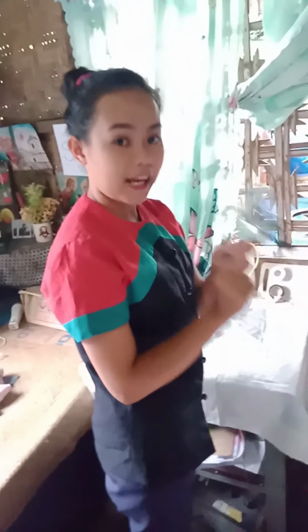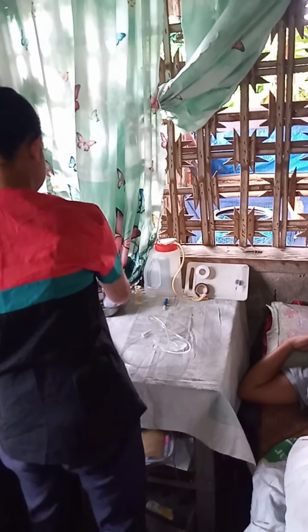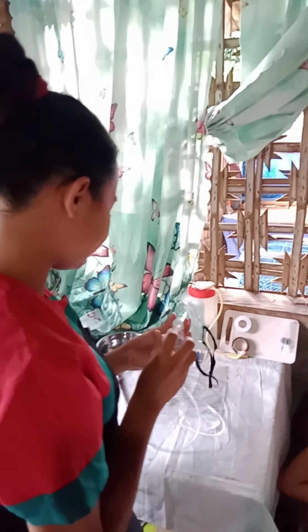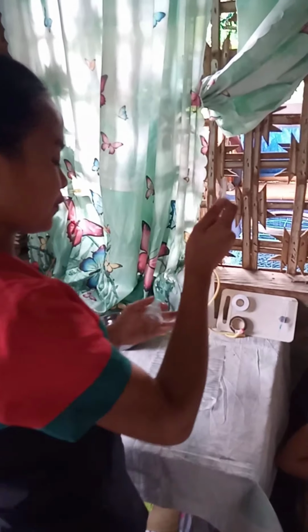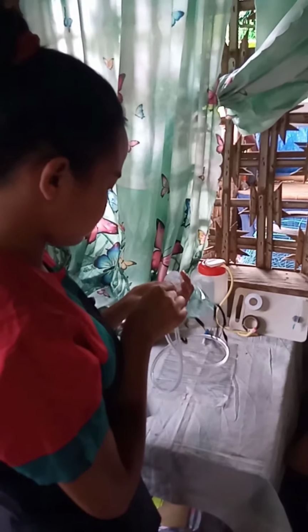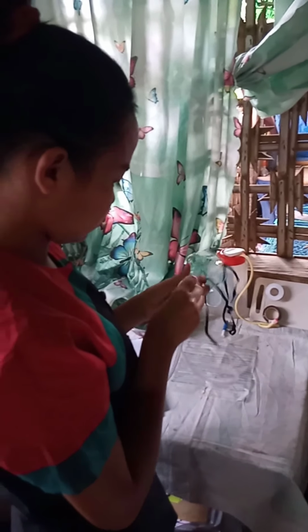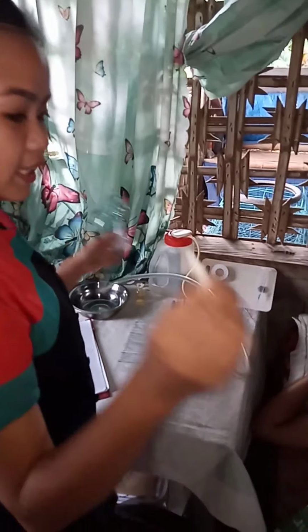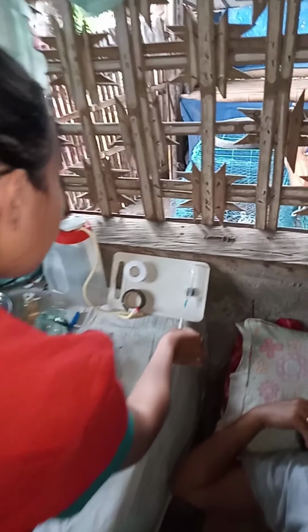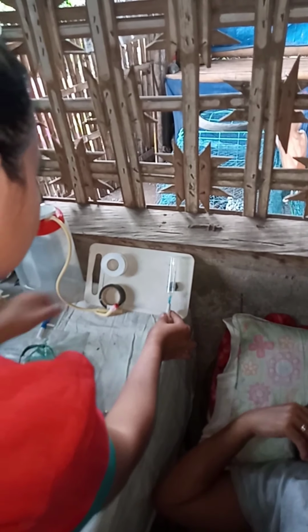In this case, we also need this connector piece of the face mask. As you can see here, I just use this as an alternative. Then attach this oxygen tubing. Then it is time to attach this to the flow meter.